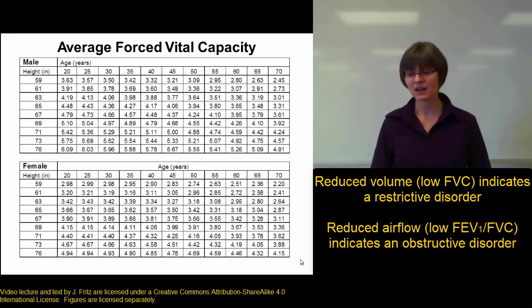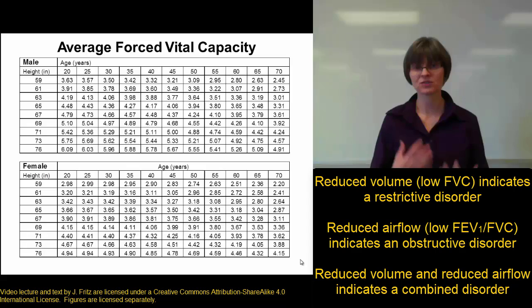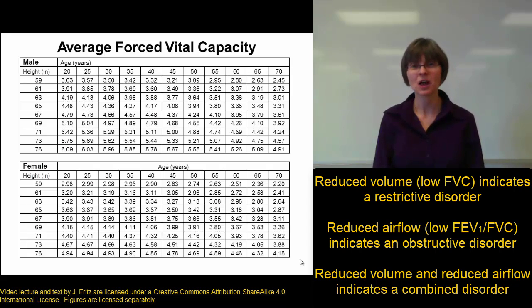That indicates an obstructive disorder. And some lung disorders are actually both. You can have some lung disorders that affect both volume and airflow, and those are called combined disorders. For more details, you should definitely check out your lab guide.